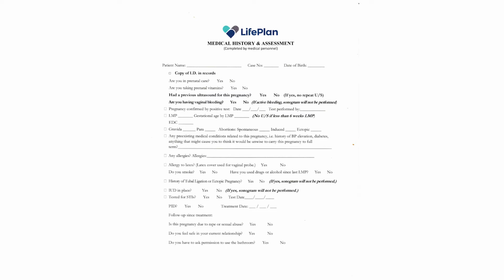So if we can get them in that window of 8 to 10 weeks, we get the best measurements. Anything less than 8 weeks, it's a little difficult to measure. Sometimes we'll get moms to come in, and they're confused about their last menstrual period. The baby ends up being smaller. And so many times with that, we will have them come in 3 weeks later and do a repeat ultrasound.